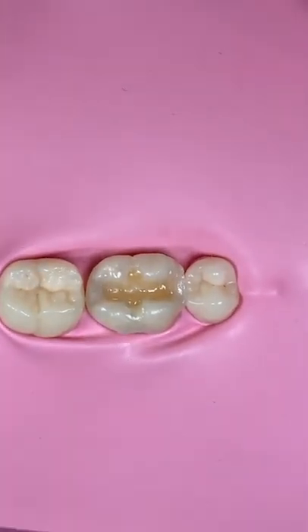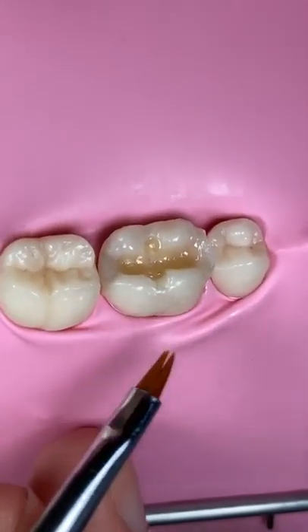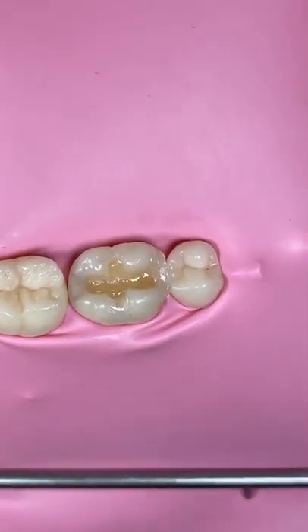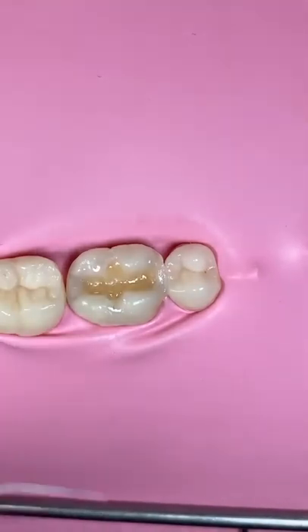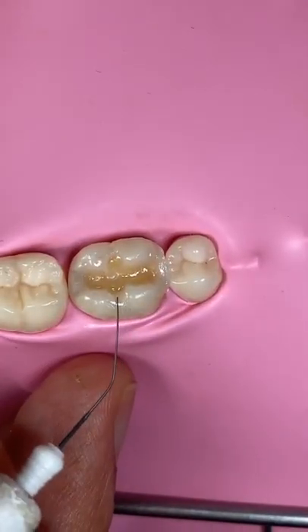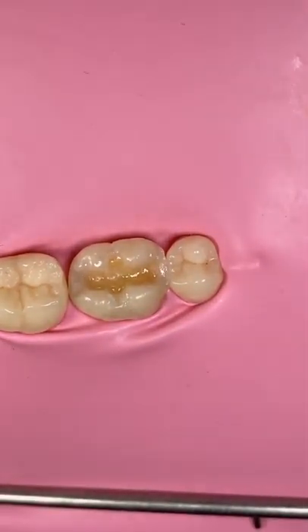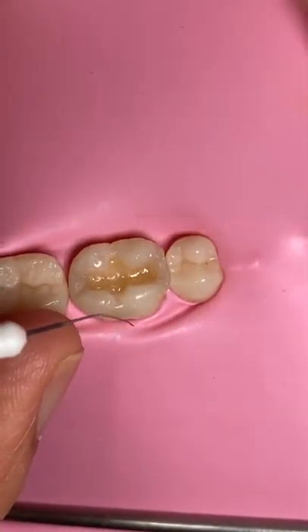Now the trick is from the instrument. Yeah, you need a very sharp instrument, the one that I use here. Just do scratching. I will take the brush first, the hair. This comes from the brush, I think. Okay. And then you do like this.